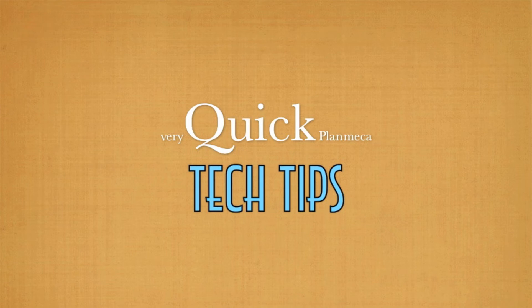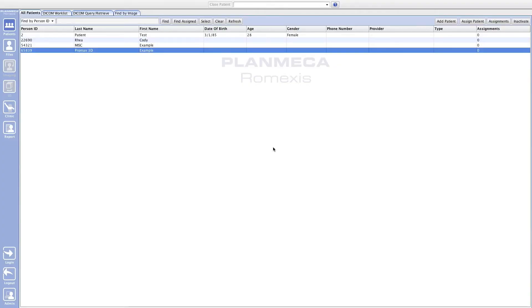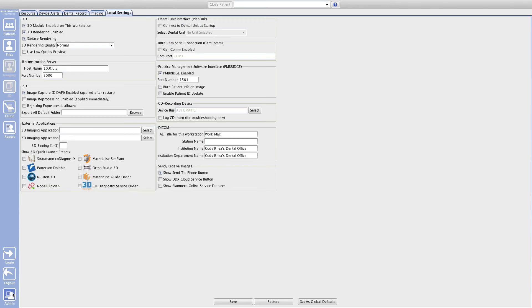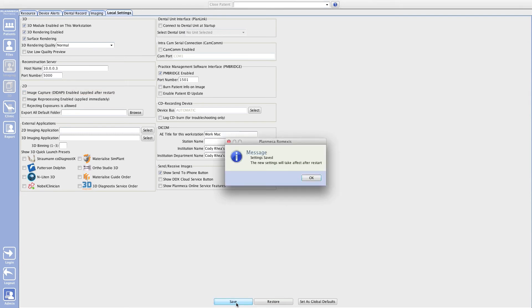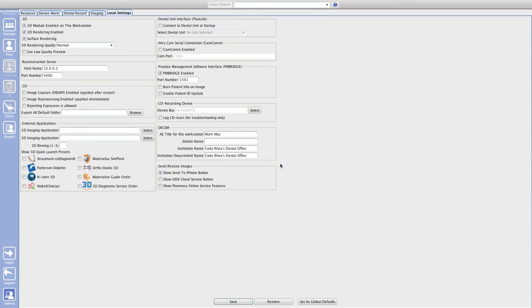But what if you don't need Didapi on the computer and you just want the error code to go away? That's what I'm going to show you how to do right now. I've already clicked OK on that error code and I'm in Romexis. Go down to the admin tab at the bottom left-hand side of the screen, and at the top you'll see an option that says 'Image Capture Didapi Enable.' Uncheck that box, click Save, hit OK, and have a nice day.